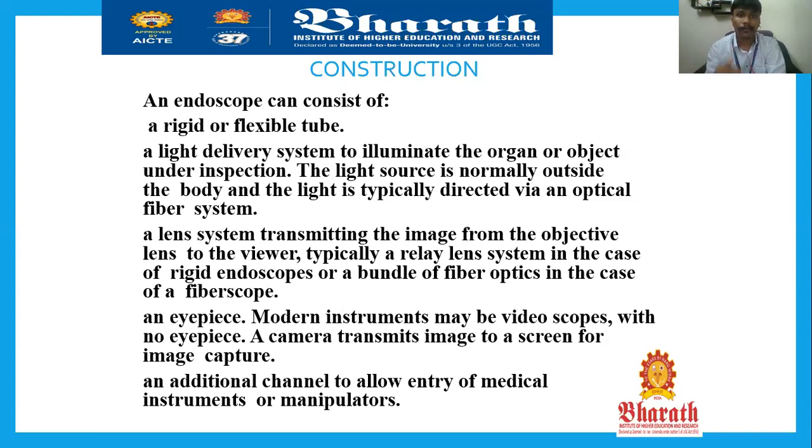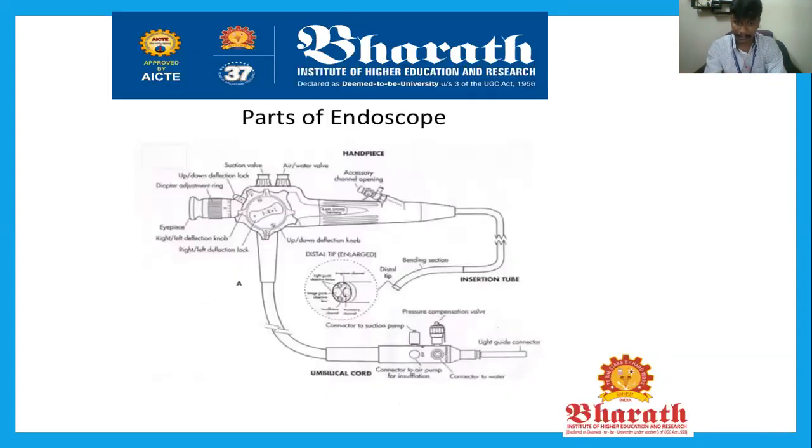and it is very helpful for the doctor for quick diagnosis and for applying quick therapeutic processes. So this is the construction of the endoscope, which has been developed to view the internal organ directly without any surgery. And these are the parts of the endoscope. This is known as the insertion tube, and this is known as a probe. We will be calling it the handpiece.